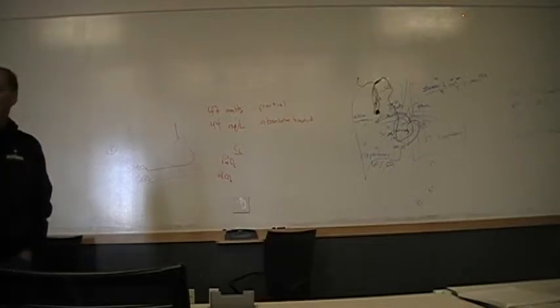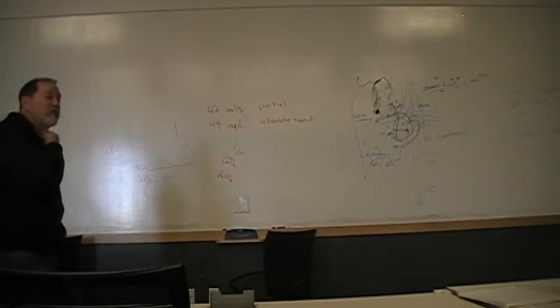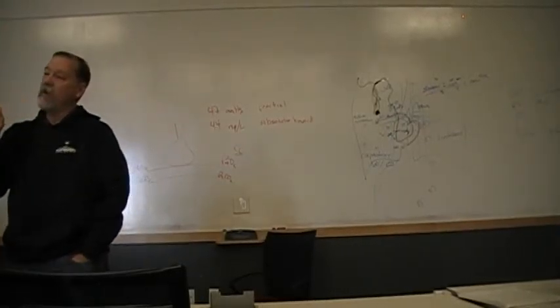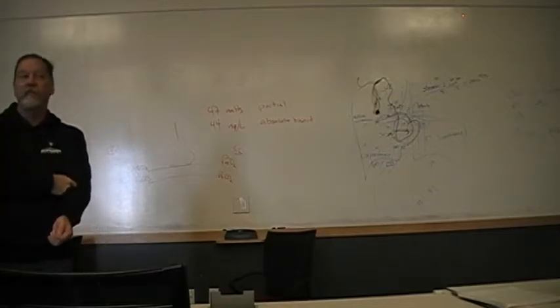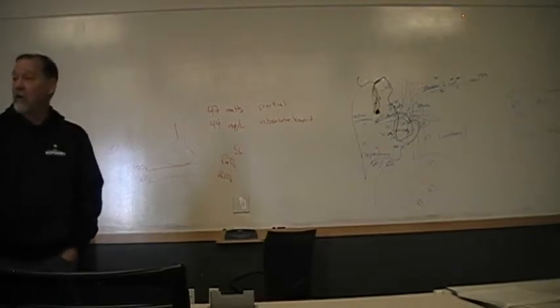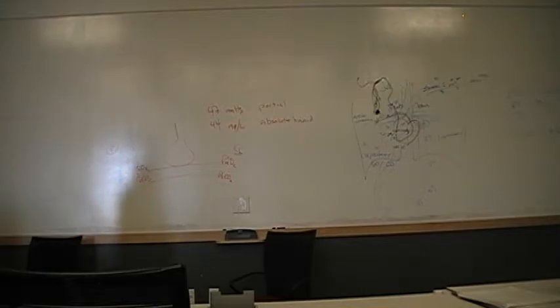So we treat patients based on what this central pressure is. We pay attention to what the CVP is, because the CVP is directly relative to preload, right? If the CVP is 0, I could maybe give a liter of fluid and get it up to 3 or 4, and that's gonna directly improve my preload. So I can improve cardiac output if I know what to do with those numbers. So these numbers are diagnostic in that they tell me something about circulating volume in the right side of the heart and what's eventually going to go to the lungs.